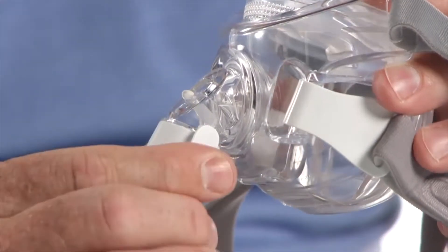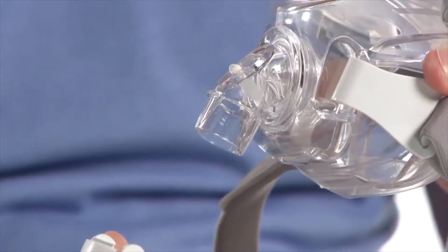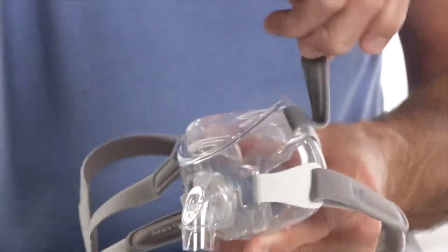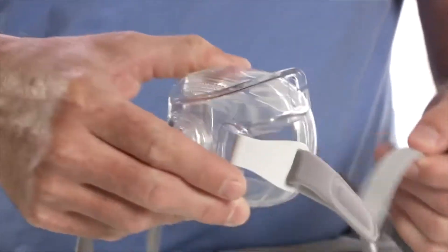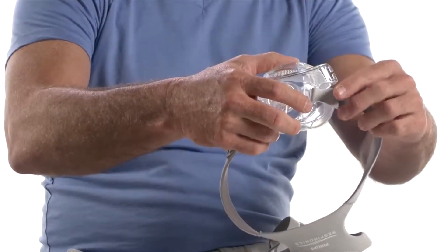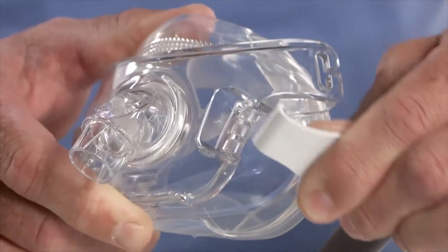To disassemble, squeeze the quick-release tab and pull the tube away from the mask frame. Undo the headgear straps and pull them out of the mask frame slots. Disconnect the headgear clips by twisting them away from the mask frame.